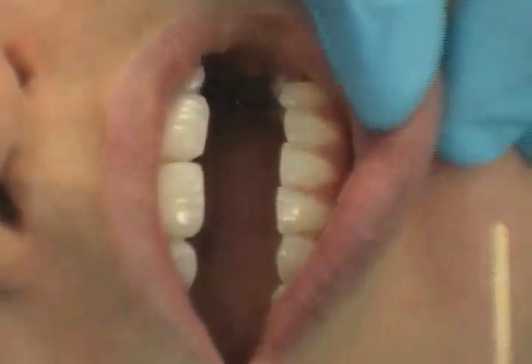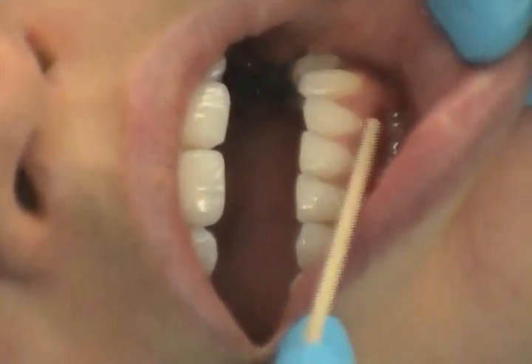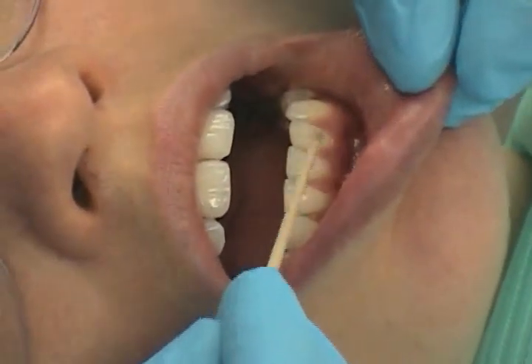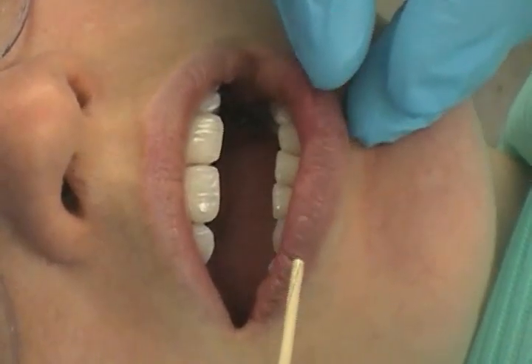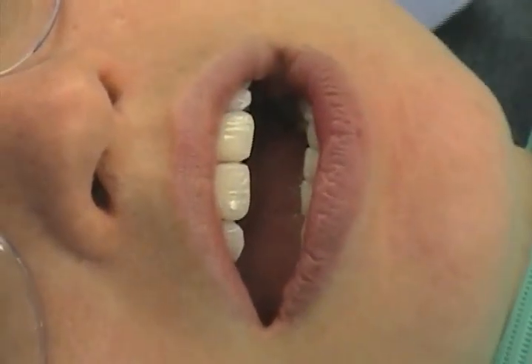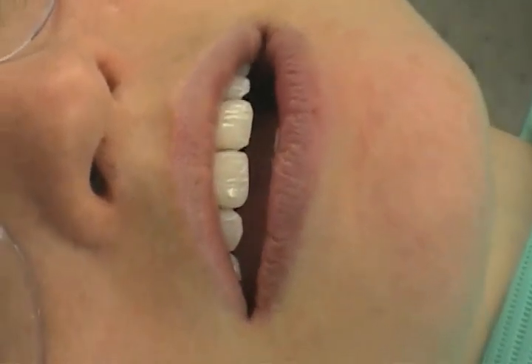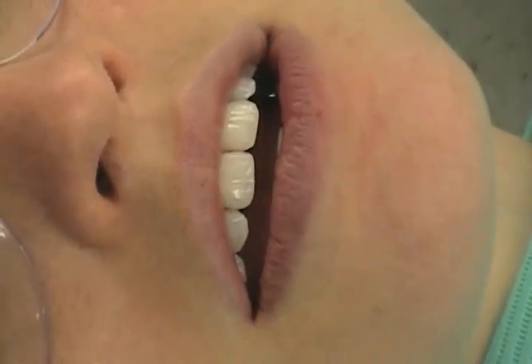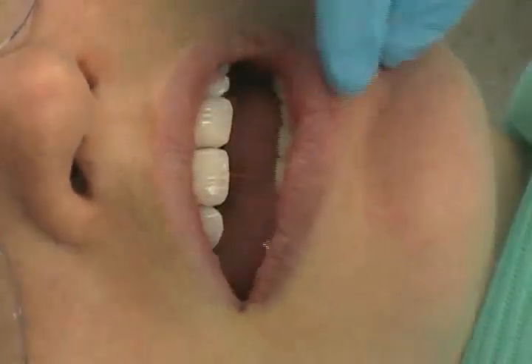For the mandibular only, you're going to use the junction of the lingual attached gingiva and the floor of the mouth, parallel to the tooth axis, near the target tooth and close to the bone. The syringe position and location of the area of the injection is parallel with the long axis of the tooth at the height of the mucobuccal fold and over the target tooth.